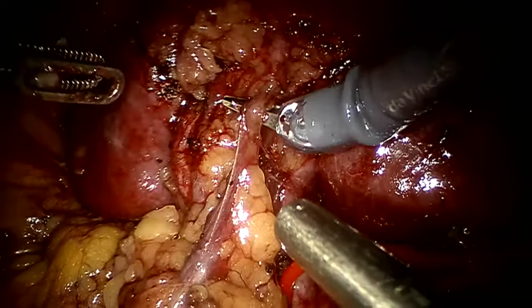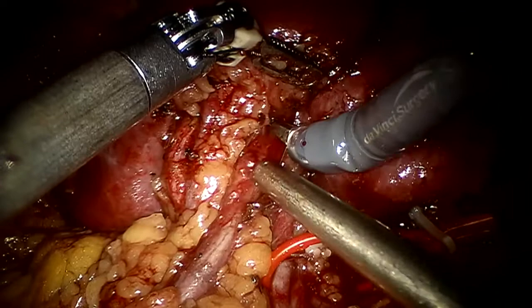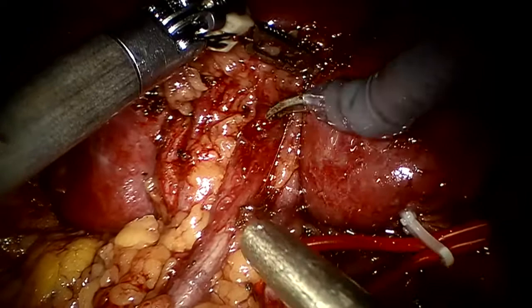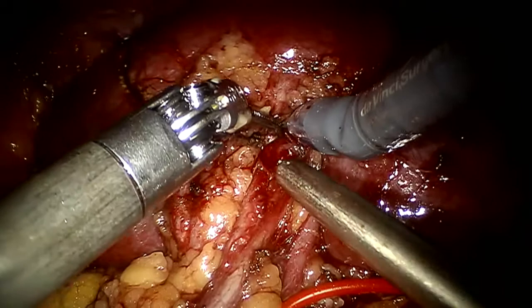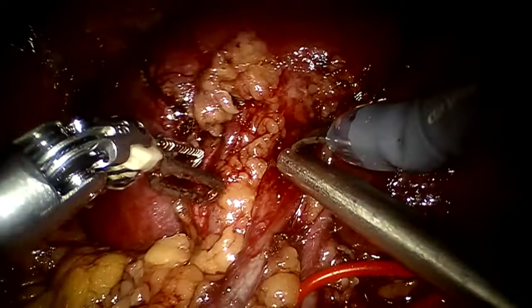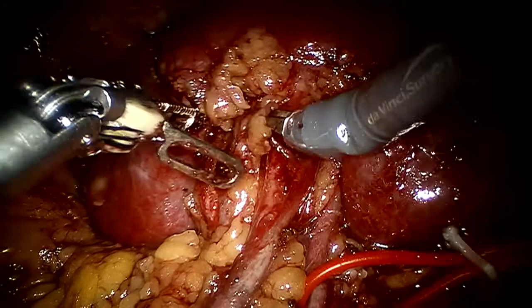Indy, will you use a Firefly? Yeah, absolutely. This would be a great one for Firefly, but unfortunately, this particular robot does not have Firefly capability. Otherwise, if you decided to clamp directly the main artery, perhaps Firefly is not necessary, no? No, it is necessary because if ever a Firefly is going to be necessary, it's in a case like this because the vascularity of the renal remnant needs to be confirmed. And it is not a guarantee that there's going to be good vascularity after we take everything that needs to be taken. So I would do the Firefly at the end of the case, after completing the repair and revascularization to see if everything is okay.